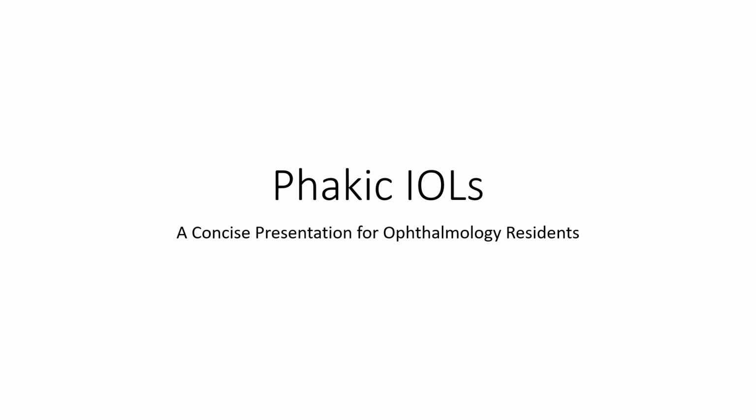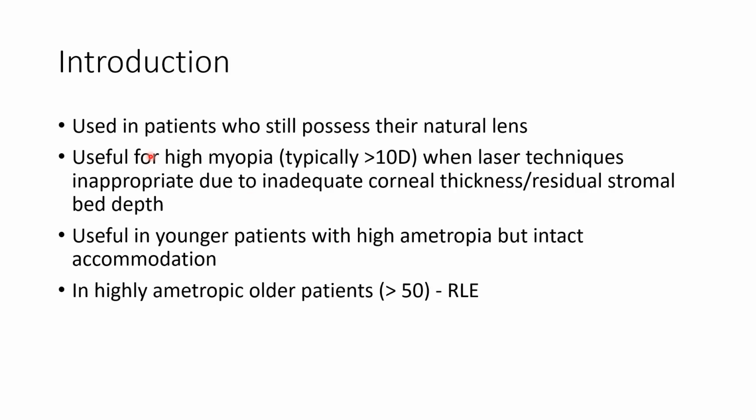Hello guys, this is Indian Medico and in this video we are going to discuss phakic intraocular lenses. Phakic IOLs are basically lens-based refractive surgeries. Phakic IOLs are used in patients who still possess their natural lens.